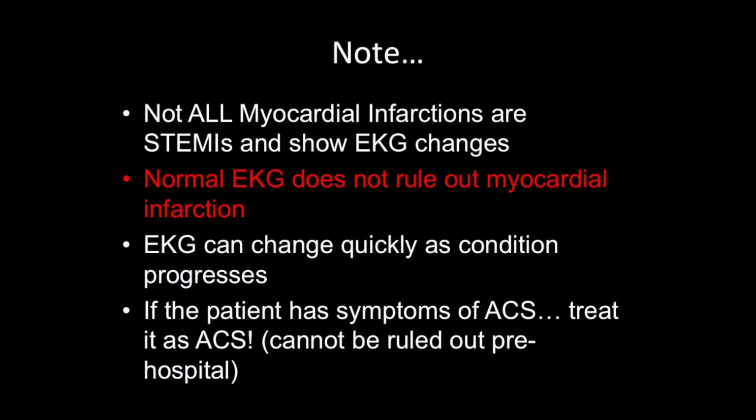Is this before or after aspirin? I would not necessarily say before or after. What I would say is maybe one person can work on the 12 lead and the other person can work on the aspirin administration. The same with oxygen. One does not have to delay the other. Okay, well, I didn't per se want to say that it delays it, but do you want the EKG before you give the aspirin, or after? There's no rule for that? It's not going to affect it?